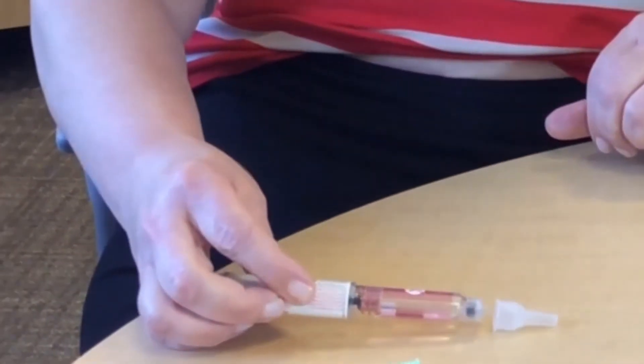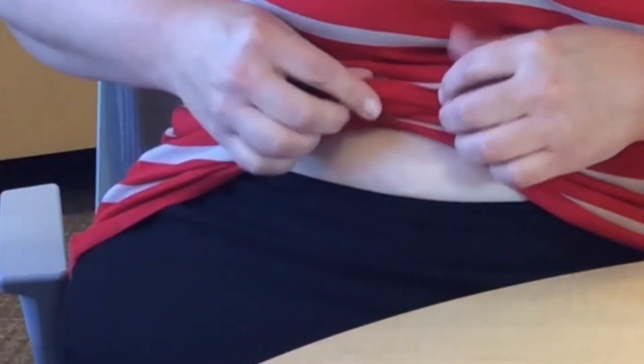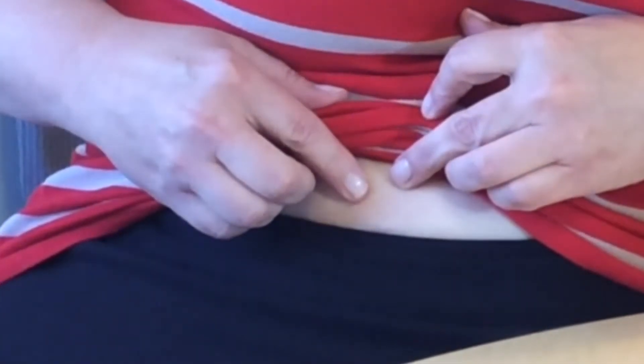I'm going to remove the needle and put my cap back on — this is the safest way, not to hold the needle. Now you can look and see. If you see a little bit of insulin on your skin, that's okay. You still have your full dose.